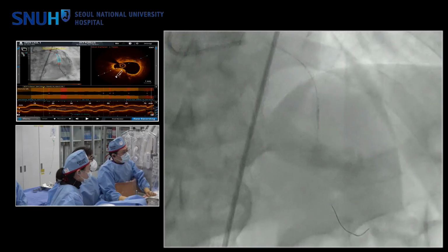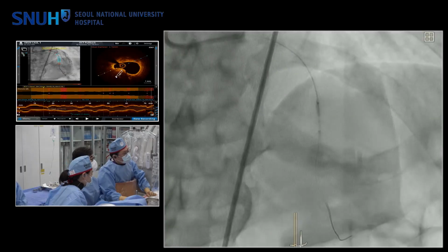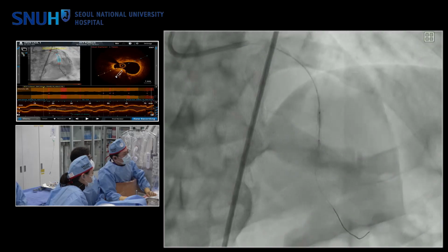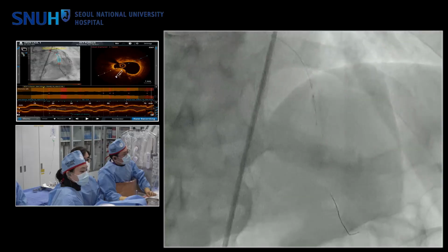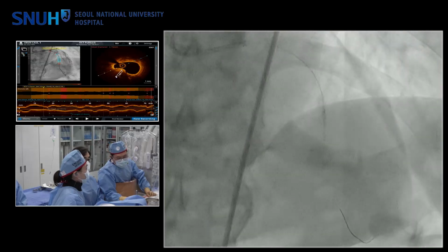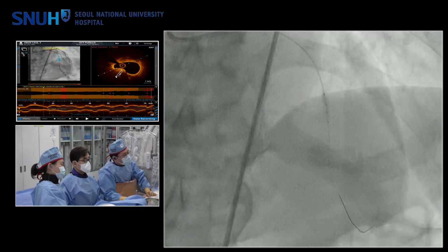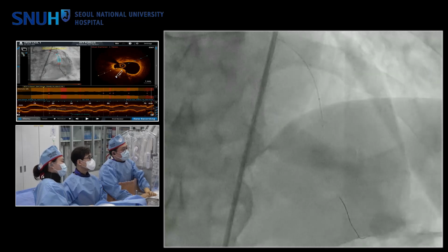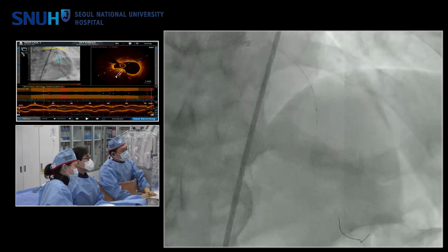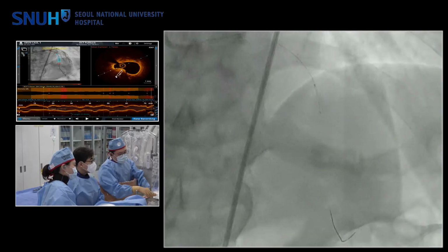The current limitation with IVL is that the balloon is 12 millimeters in length. So here you have 6 segments, and you're going to deliver 20 pulses each. That's assuming the balloon will profile. So it's going to be a minimum of 120 pulses, right? It is cumbersome. If you think about atherectomy, you make a couple of passes, let's say with a 1.5, it should go pretty smoothly. It's going to be very feasible because it's not tortuous, it's not angulated. So that's something that I would have considered.